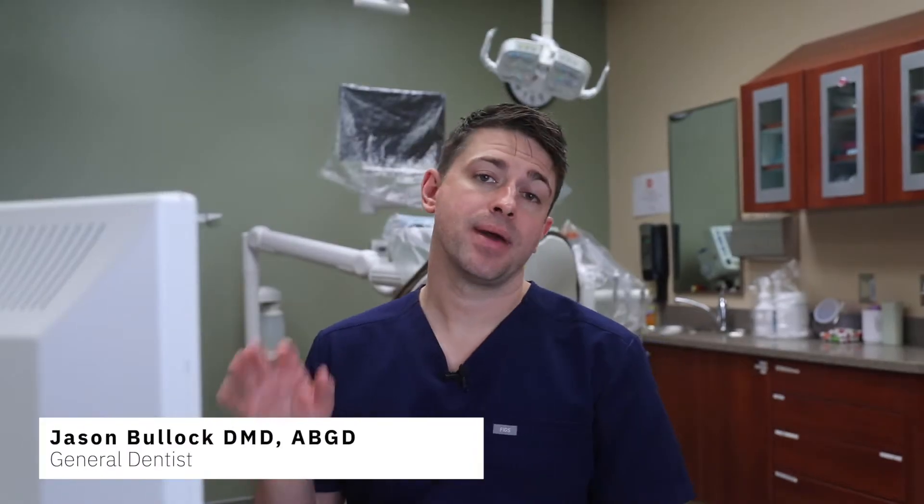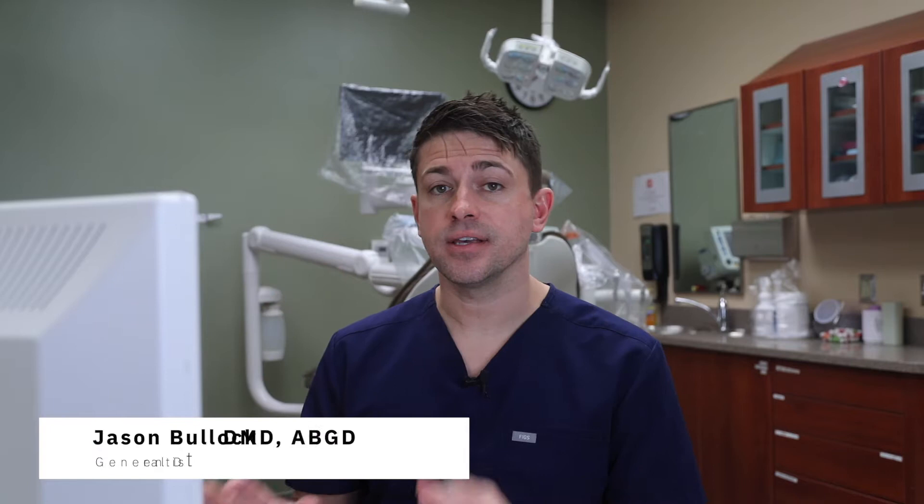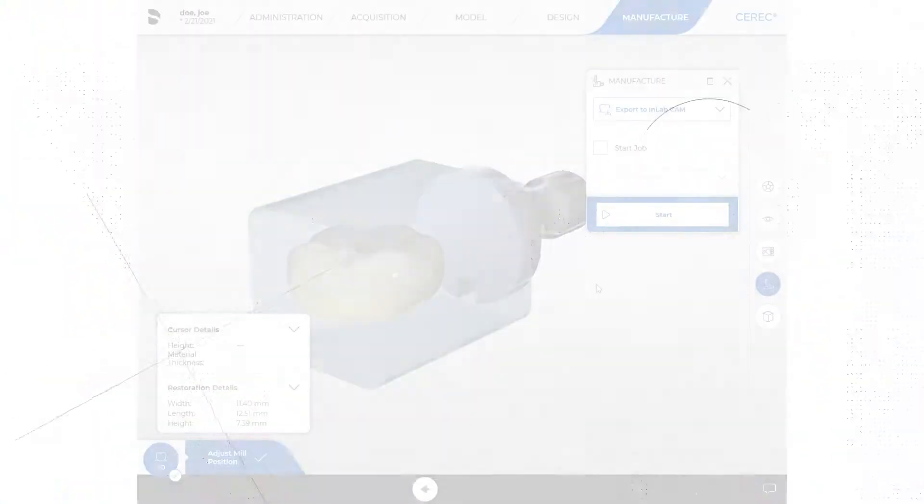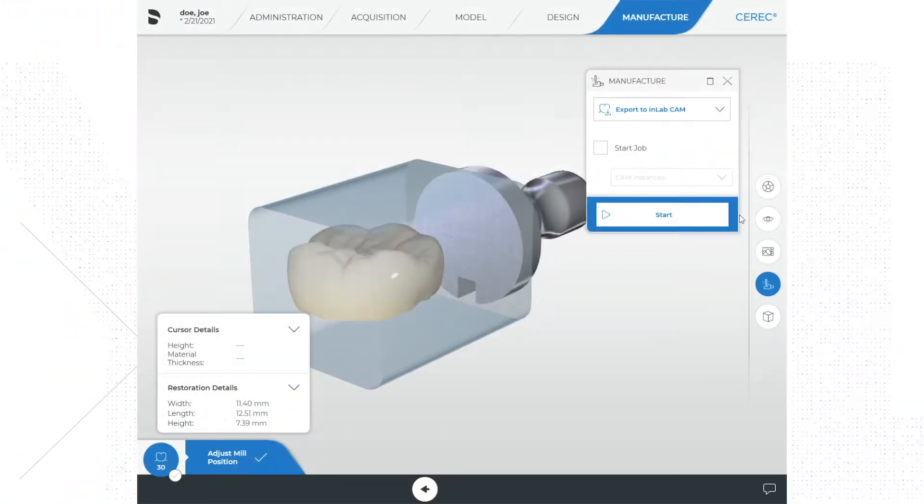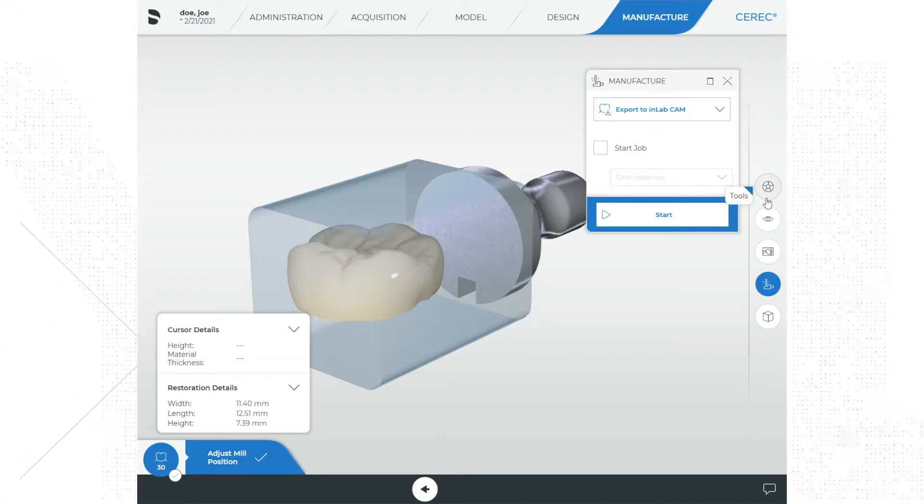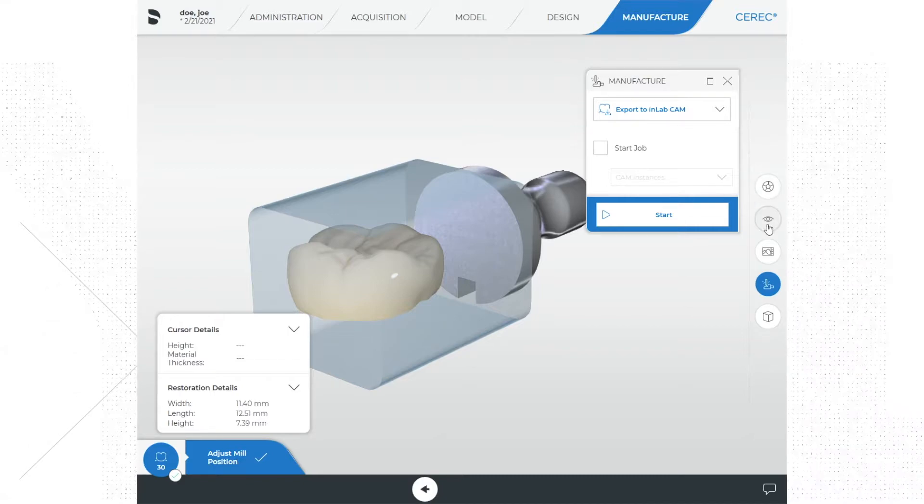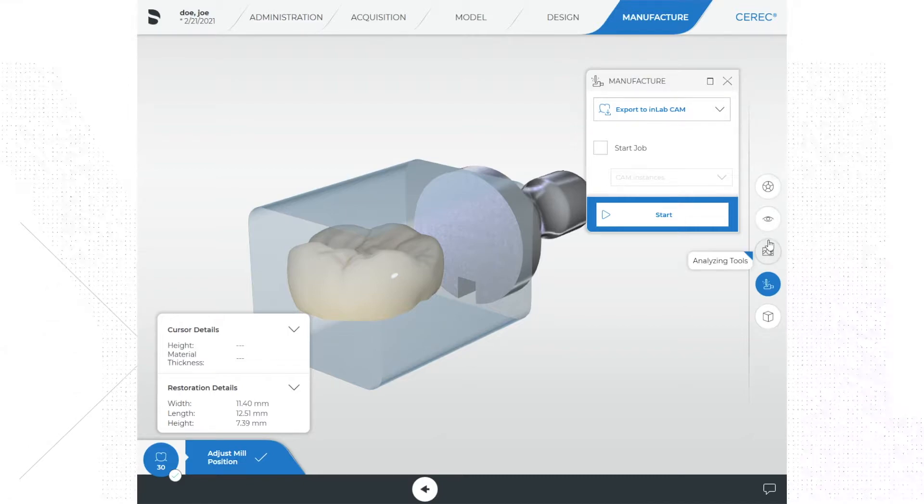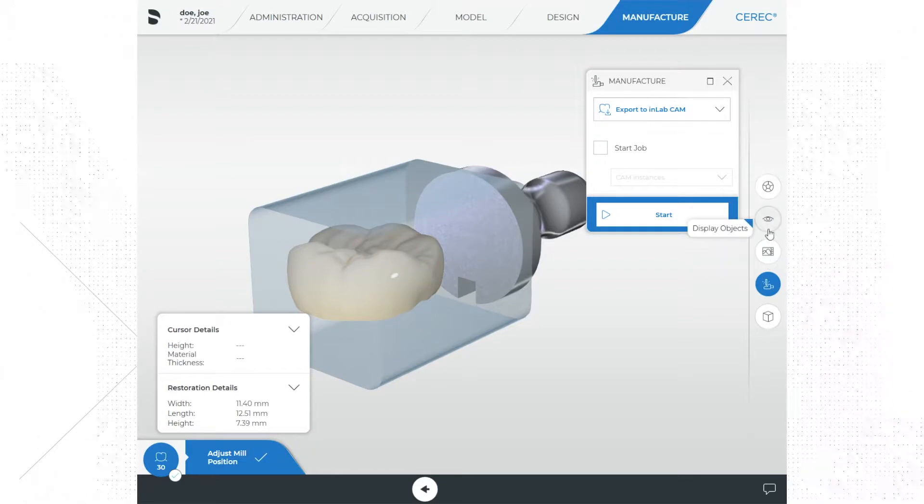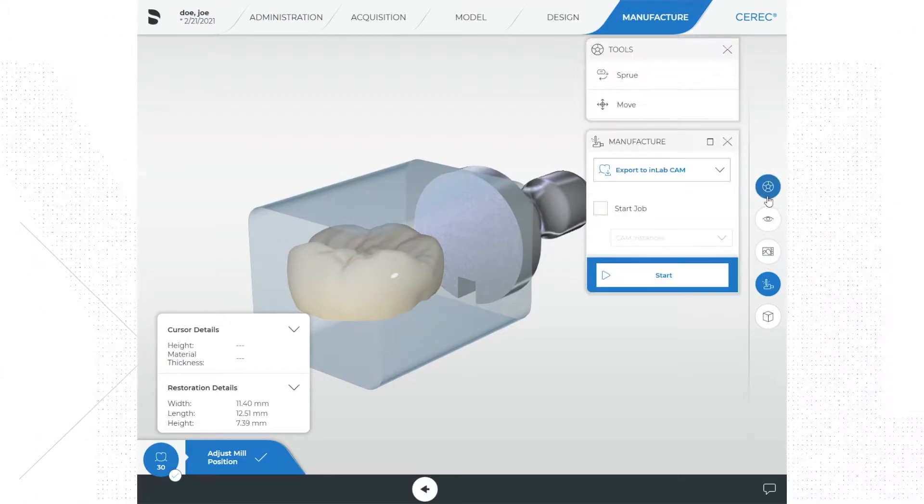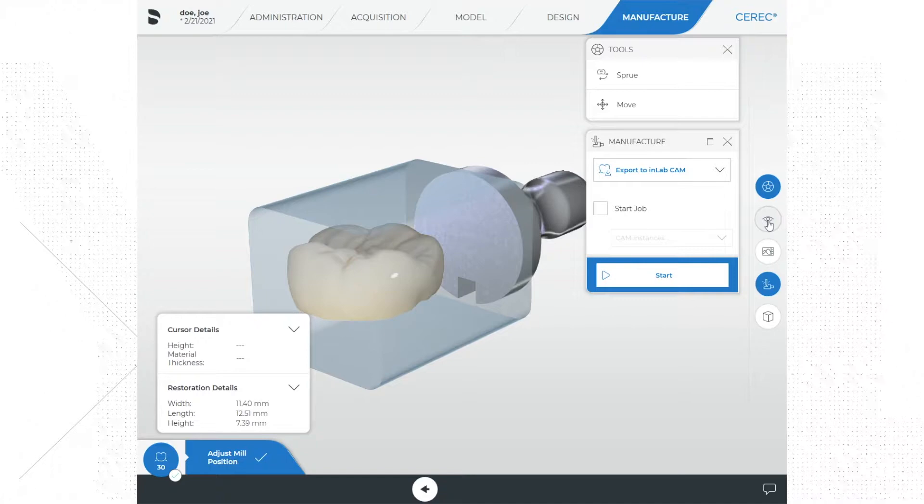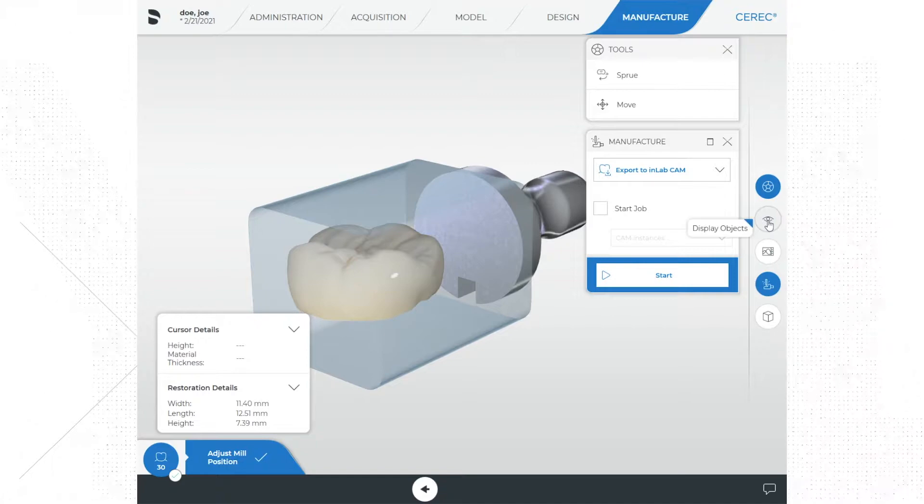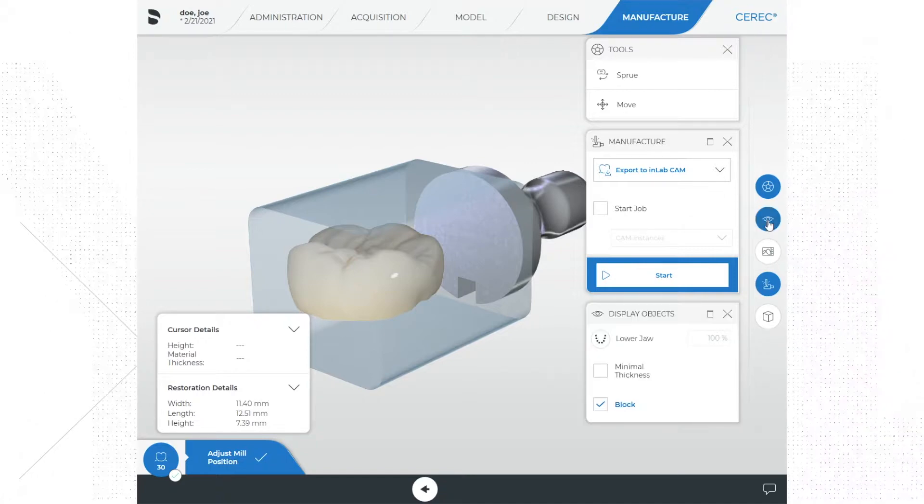Now we are in the manufacturer or mill phase of the CAD CAM design. We have a few menu options within this phase of the process. You will notice menus for display objects, view options, and analyzing tools—menus you've already seen before and should be familiar with. Use those as you see fit or how best works for you.